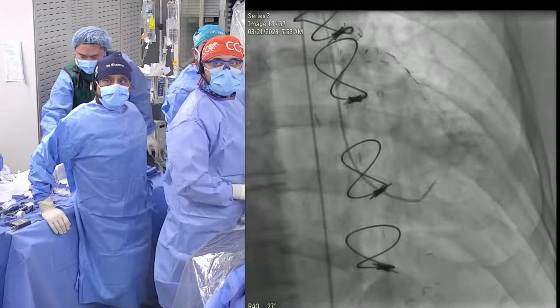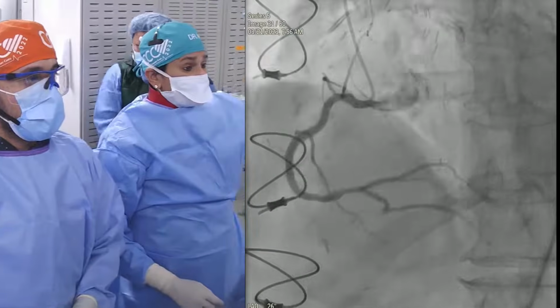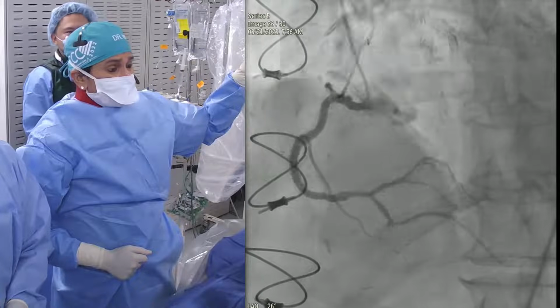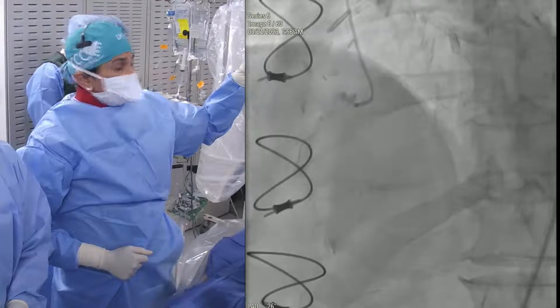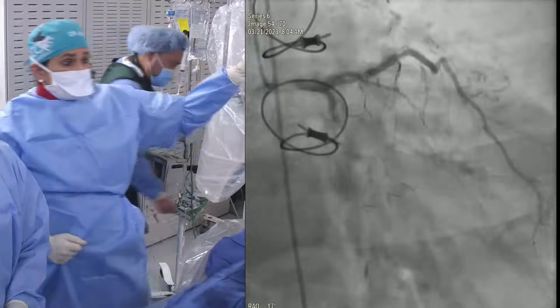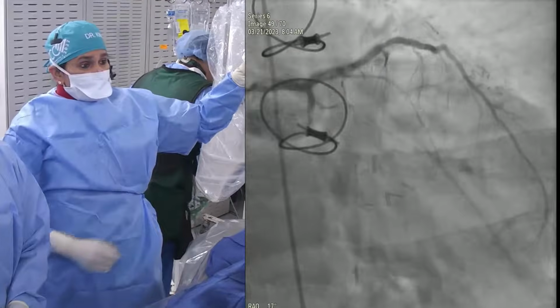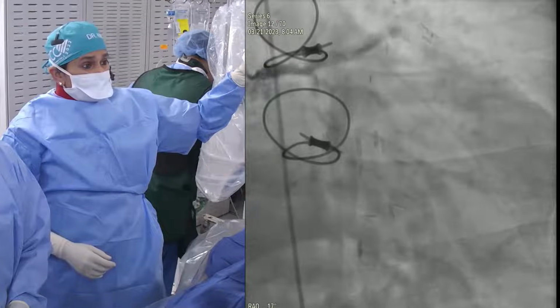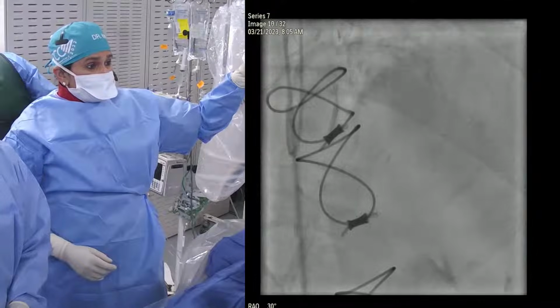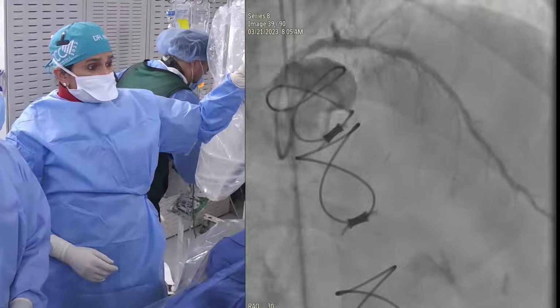Okay, we can show the angiogram now. So you see the LV gram, good, normal, about 45. Right, it has been read at about 45-50% most of the time. You can see the right coronary artery has the Promus stents, two stents you put, which look good. This is the left side. The LIMA attachment you are able to see in the RAO view, the tenting; LIMA is gone. I'm just thinking, is there left main disease also? Well, with imaging you'll find out how much it is.